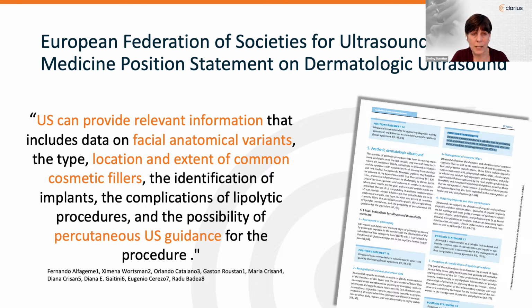The Clarius L20, which Dr. MJ will be using to show us how she treats misplaced fillers, is the only wireless scanner that satisfies these technical recommendations and has very specialized presets for aesthetic and dermatology applications, as I'll show you later.